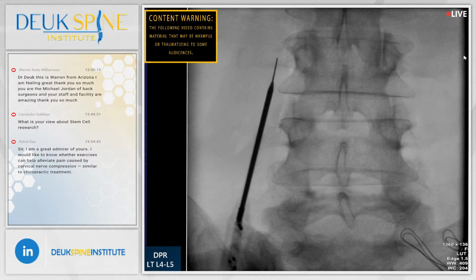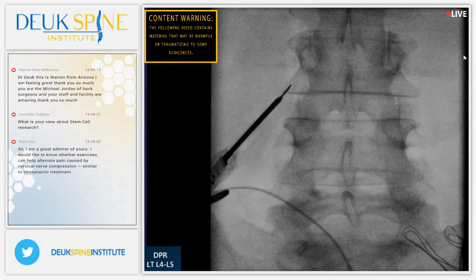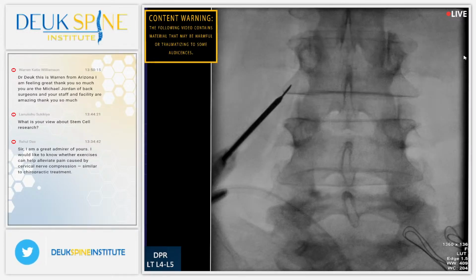All right, welcome back. I've just been trying to target the right spot to destroy the pain nerve here, and finally got the proper location. The first step here is for me to place my probe on exactly the right spot to treat.